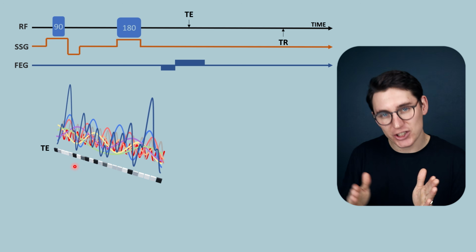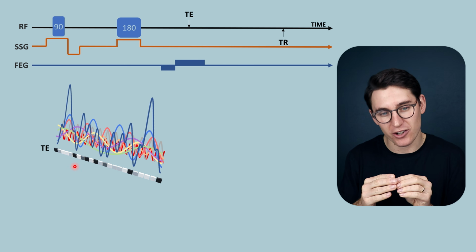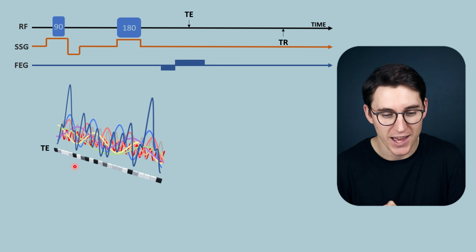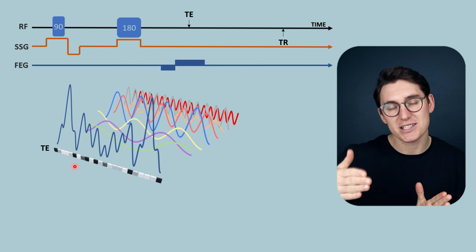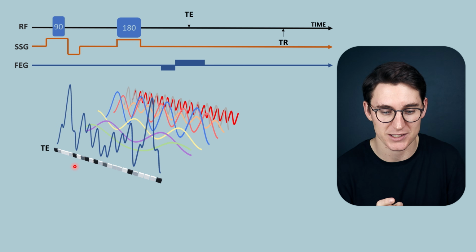And it's only the change in time, when we compare each of those numerical values over a period of time, that we can use them to calculate which specific combination of frequencies and amplitudes will give us this unique digital signature. And this mathematical equation will allow us to tease out the various different frequencies that are going to contribute to this ultimate net magnetization vector that we've been measuring from that slice.